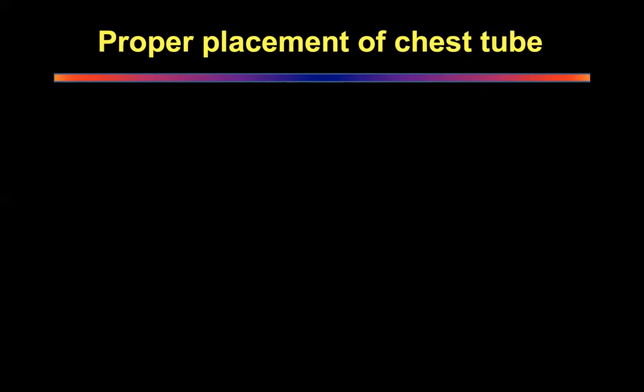But I cannot stress enough that the one most important factor of post-operative problems is an incorrectly placed chest tube. You'll be surprised the number of times the tube gets pulled back, or the hole comes into the chest wall because you've forgotten to tie it properly, or because you didn't place it all the way to the apex, so you're not draining the apex completely.